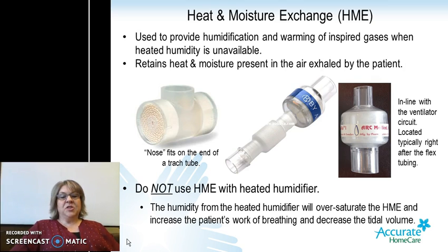Do not use the HME with a heated humidifier. The humidity from the heated humidifier will oversaturate the HME and increase the patient's work of breathing and decrease the tidal volume.